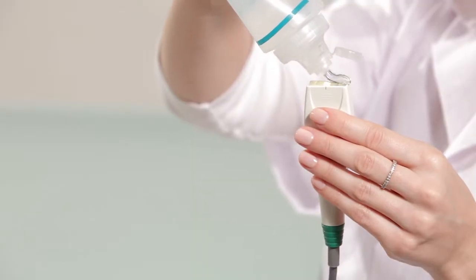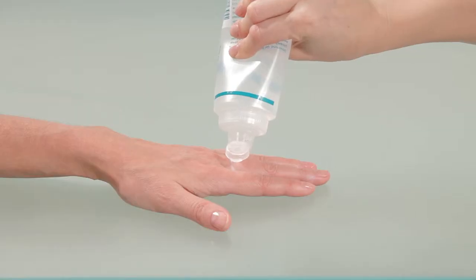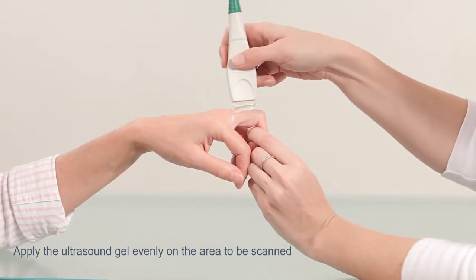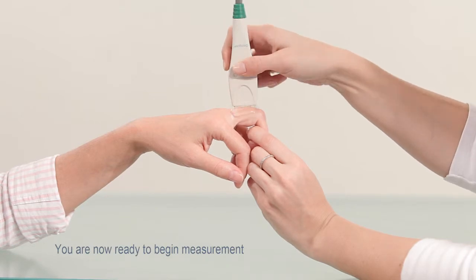Apply a thin uniform layer of ultrasound gel on the probe surface and on the finger. You are now ready to begin measurement.